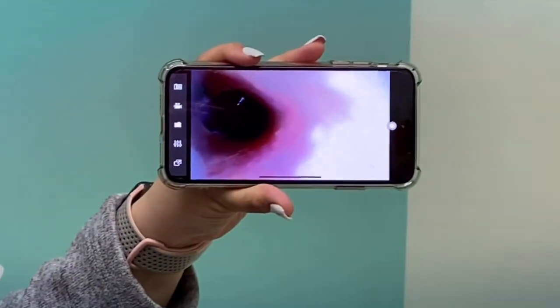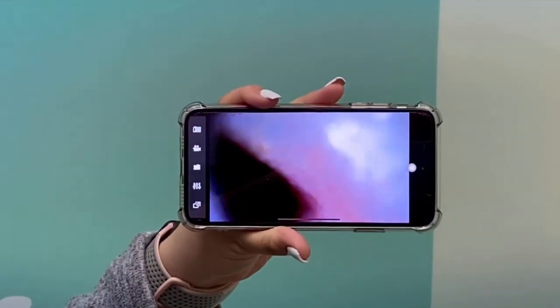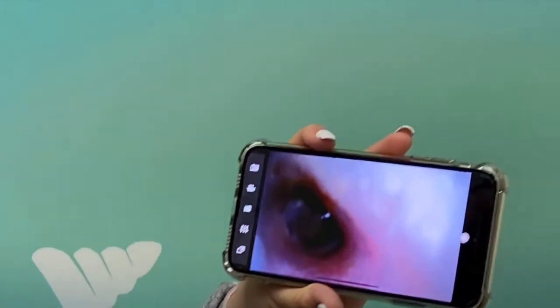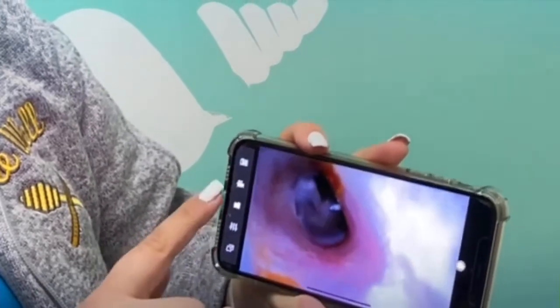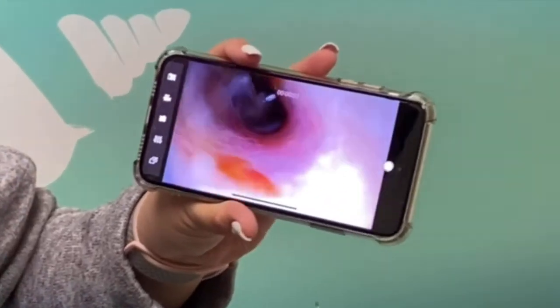We can clearly see everything and you can kind of point it around to see different parts. There's also a cool feature on here where you can take pictures and video. Sam, do you want to go ahead and take a picture with that little white dot in the corner? Took a picture. And then if we wanted to go ahead and take a video, you do it in recording mode and then push that little button — and we're taking a video.